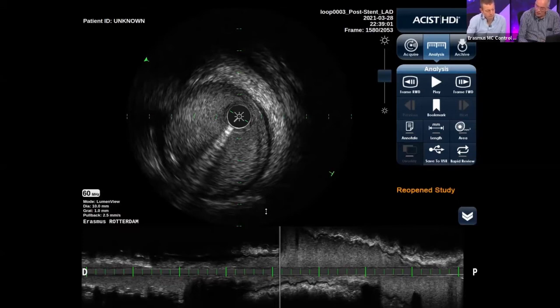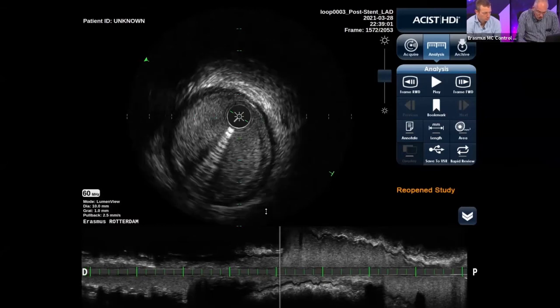Absolutely. That way you always know: I start distal and I end proximal. So I just want to ask everyone who is still vacuum cleaning in the vessel, that means going up and down with your catheter and hoping that you see something, to quit with that, because then, as Joost just mentioned, your references are worthless, of no use anymore. If you do motorized pullbacks, you start to get a sort of standardization, and IVUS becomes easier to perform, because everyone will do the same. So keep your vacuum cleaning for at home to help your spouse, but not in the vessel.